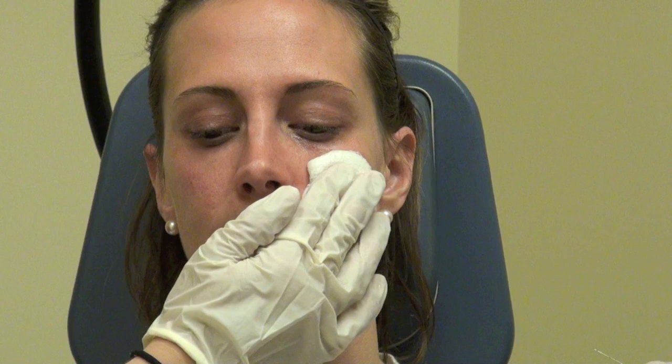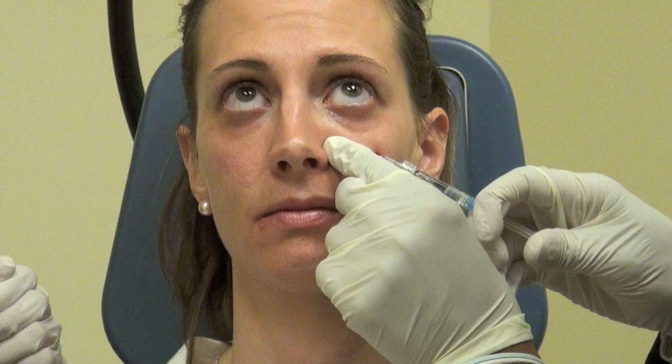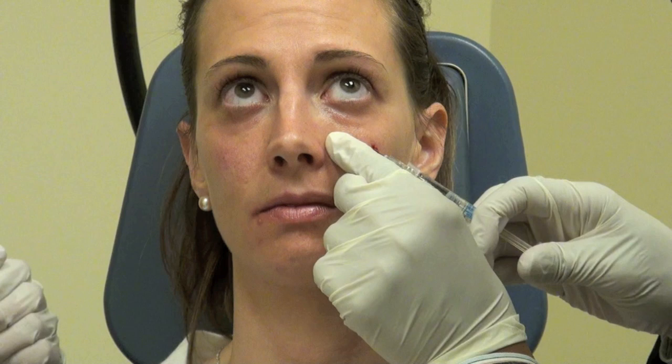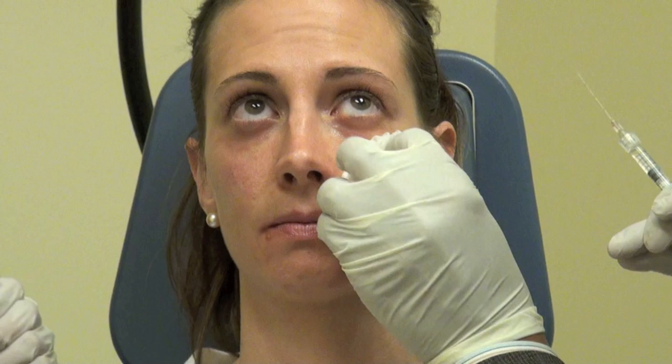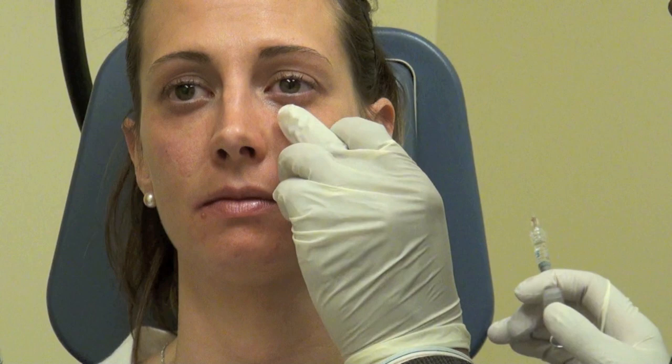So we're using Restylane — eyes up to the ceiling. Restylane is by far my preference in the tear trough proper. This instrument is called a cannula. It bruises tremendously less than needles. We've been using cannulas in general for many months now, and under the eye for probably four or five months. It's very natural for us because when we do fat transfer, it's a very similar instrument. And the other nice thing is it's pretty painless. Would you agree? Mostly don't feel it? I don't feel anything.